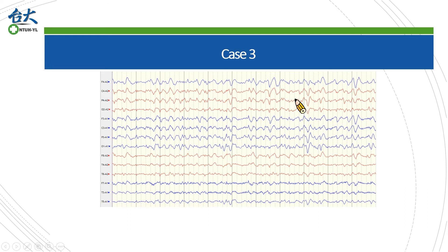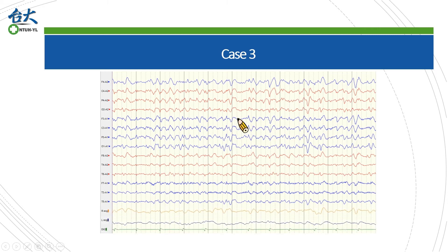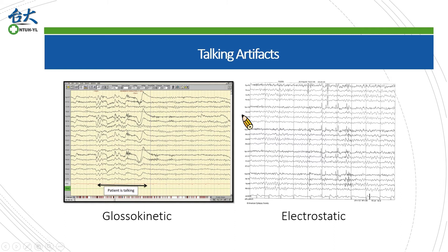Case 3 is more difficult than the previous two cases, so I'll show you the answer directly. In this A1-A2 referential montage we can see synchronized delta-range activities in the parasagittal traces. These waves are less obvious in the temporal traces, suggesting these artifacts may come from the motion of A1 and A2. Just like case 2, you could guess the subject was talking if you see motion artifacts in the temporal region.